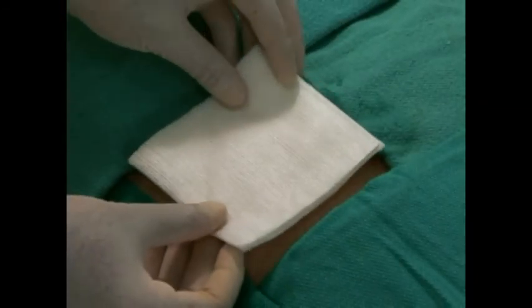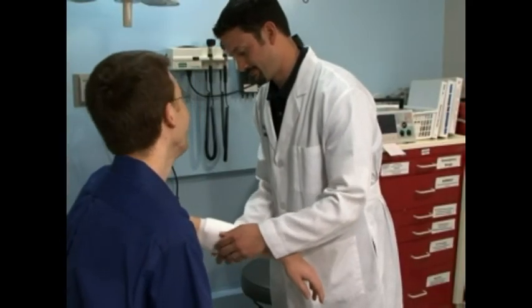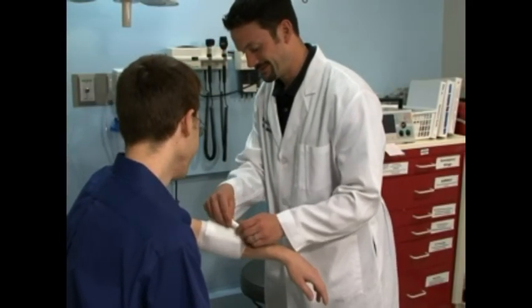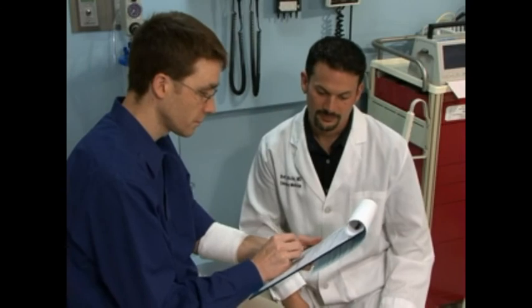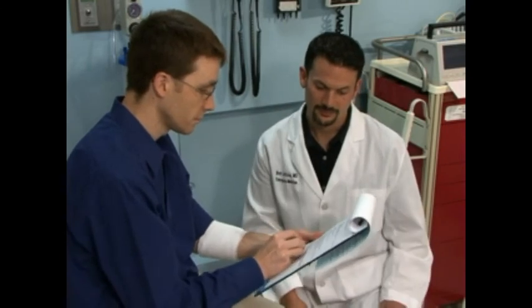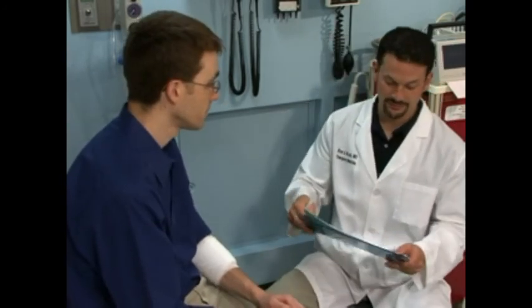Cover the abscess wound with a sterile, non-adherent dressing. Topical antibiotics have a limited benefit and are not required. As with any wound, be certain that the patient's tetanus immunizations are up to date. All abscesses should have packing removed in a few days, and most patients with wounds that have packing in place should be scheduled for a return visit for follow-up and packing removal 2 to 3 days after the procedure.